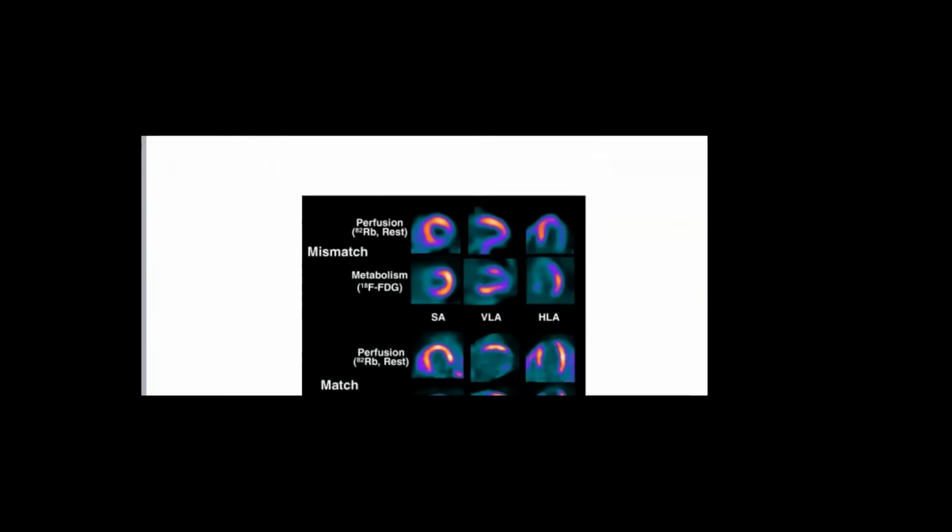Of course, as we agreed, in the perfusion map you don't have to focus on the entire perfusion map to get confused. Where is the perfusion defect? Tell me, where is the perfusion defect? Inferior wall and lateral wall. You agree with me? In the upper row.